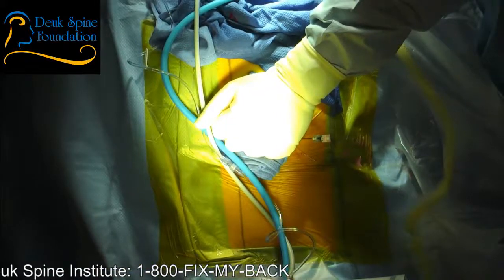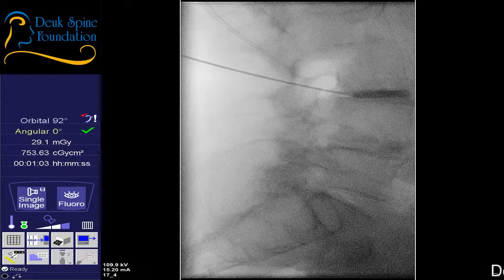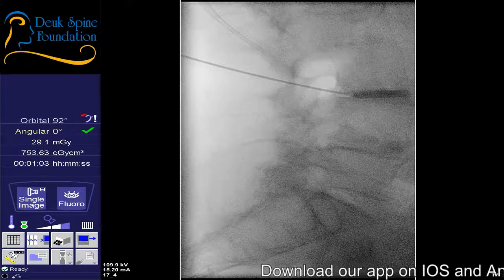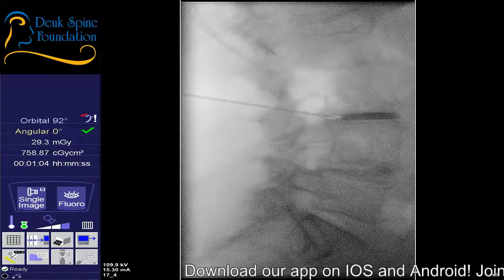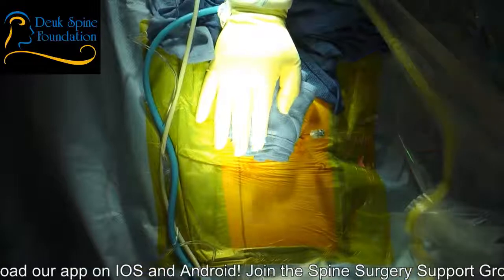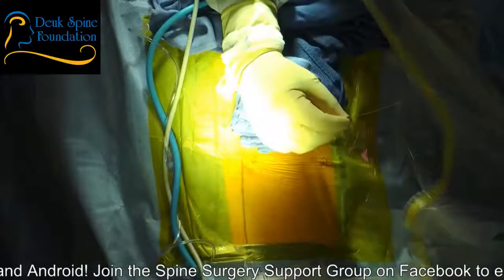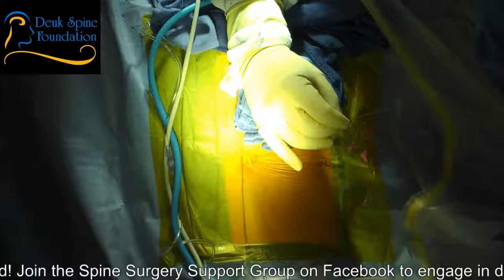All right, shot. Okay. Not too bad. Can the fluoro drop to the floor anymore or no? All right, it's fine. It should be fine. Let's try to wag that in a little better. Especially the L4 pedicles. They don't look so good. For those of you who have been watching, have you noticed how little blood loss we've had? We've lost probably about 3 milliliters of blood. 3 ml. There's nothing. If you cut your finger, you're going to lose 3 ml of blood. So we've lost essentially the equivalent of a finger cut with this surgery.